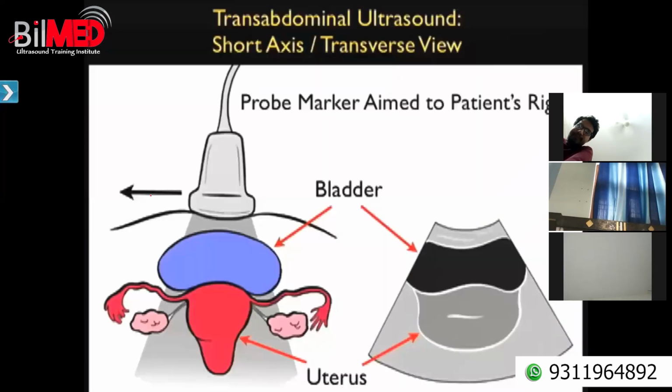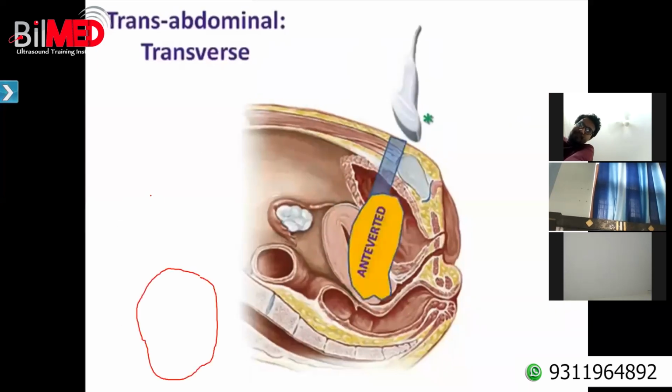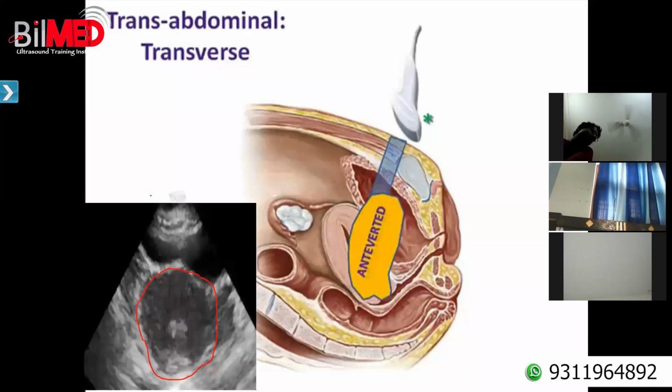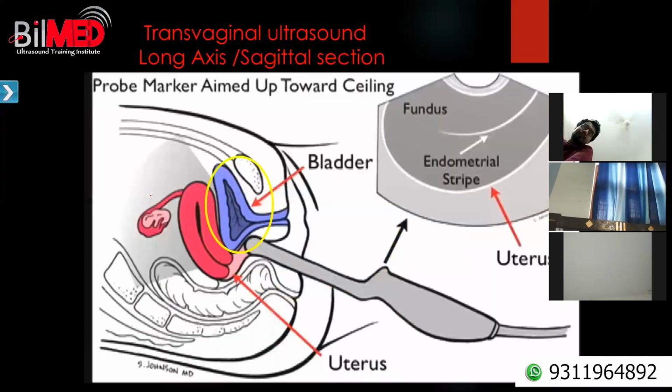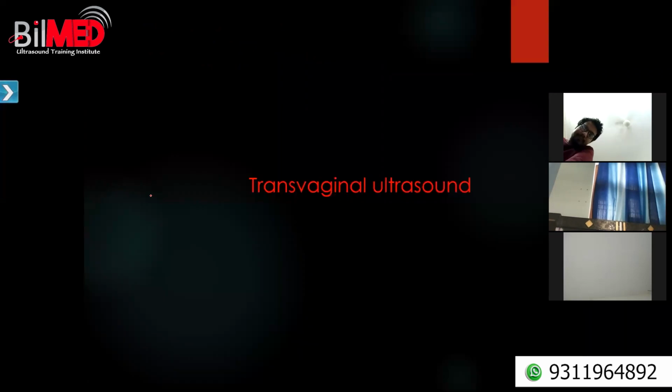Good. So till now we have discussed the transverse and longitudinal sections. We have discussed the basics of these pelvic spaces and these muscles. Now let us see what next is. TVS, transvaginal probe. Dr. Namita, are you doing TVS scans also? Yes, sir. Very good.